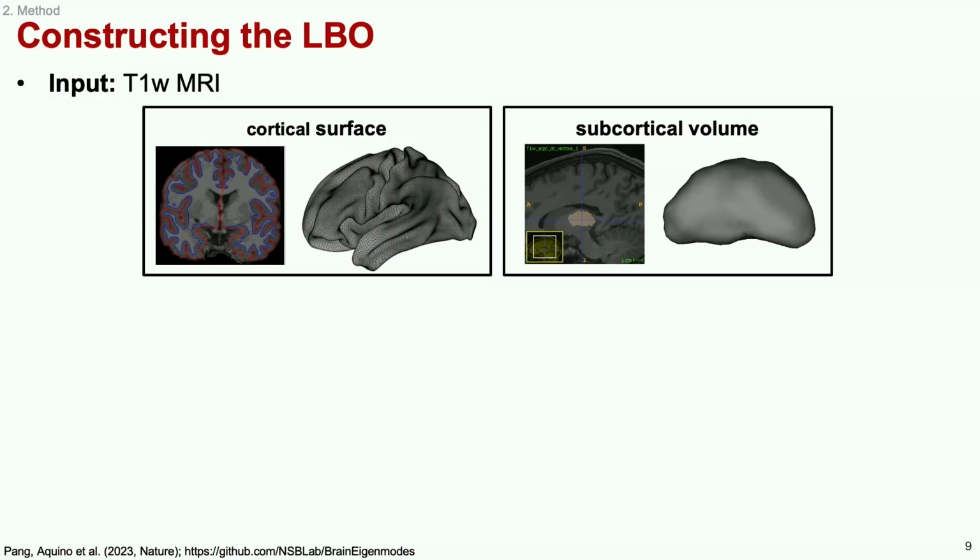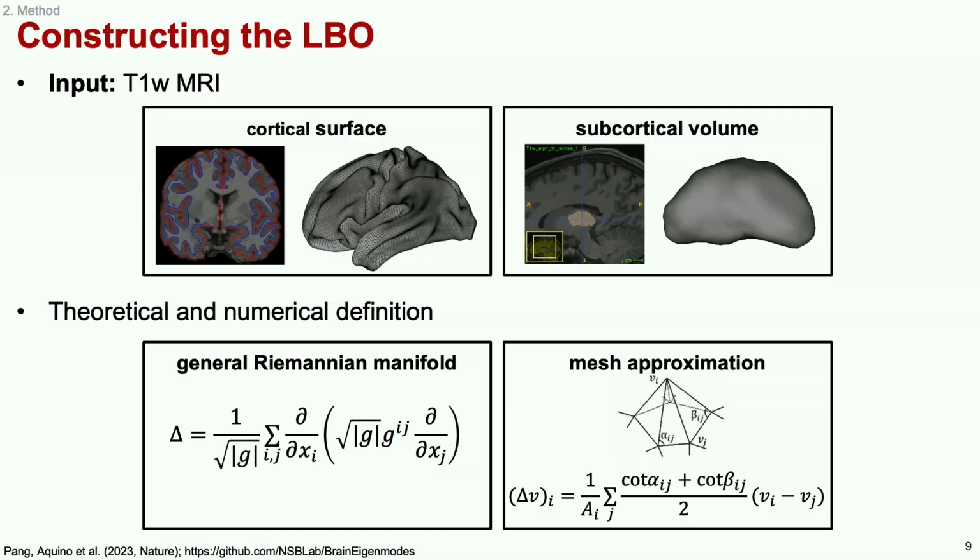You can also look at volumetric structures that can't be easily defined by these simplified surfaces. So say you have the volume of the thalamus. The idea is you just take a mask of that structure, and that's exactly what I'm doing in here. Whatever that color is, gray, or maybe I'm colorblind, that's just a mask of the subcortical thalamus, and I would have this image, which is literally just in voxel space. It's three-dimensional voxel space. So again, in cortical surface space, you have vertices that are connected to reconstruct that surface, but in volume, you only need just the voxel space volume.